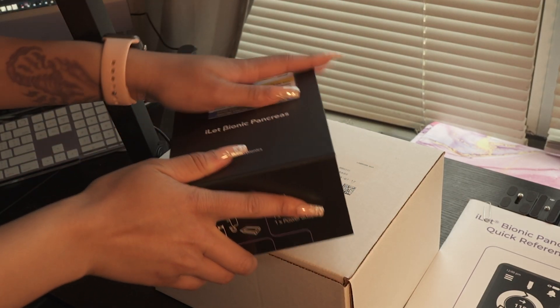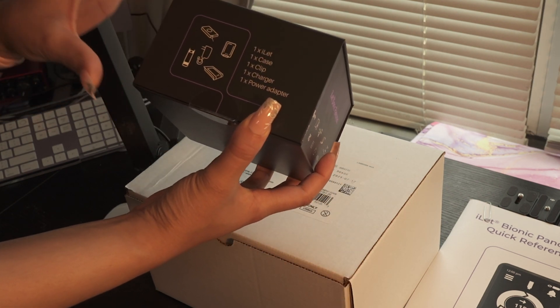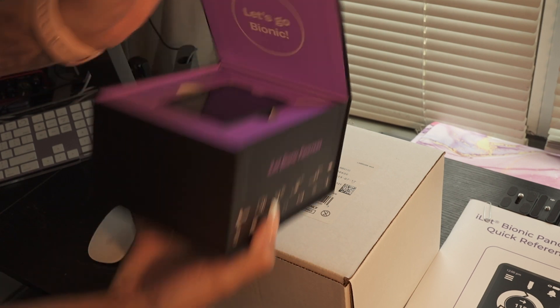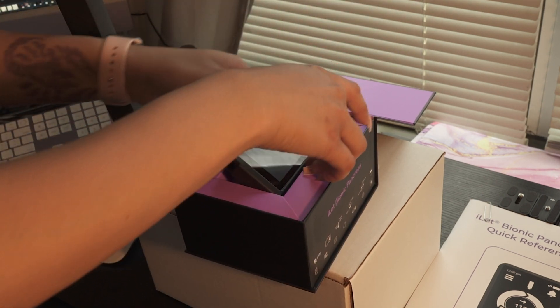Hey everybody! Today we are going to be unboxing the iLet Bionic Pancreas. It comes with the iLet itself, the case, the clip, a charger, and a power adapter. Let's go bionic! I love the purple — not gonna lie, that's my favorite color.